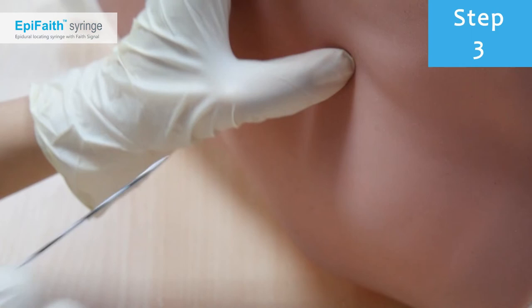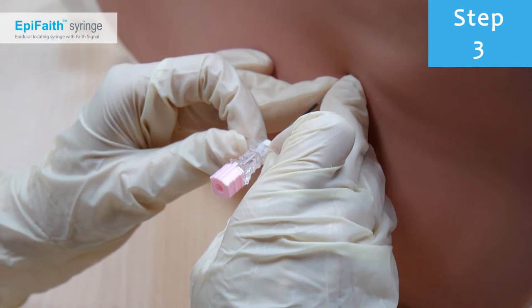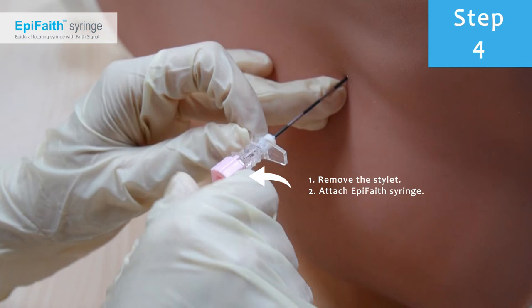Before attaching the syringe, insert the needle through the tissue until it is situated in the appropriate region — for example, the ligamentum flavum. Then remove the stylet and attach the filled syringe to the needle.